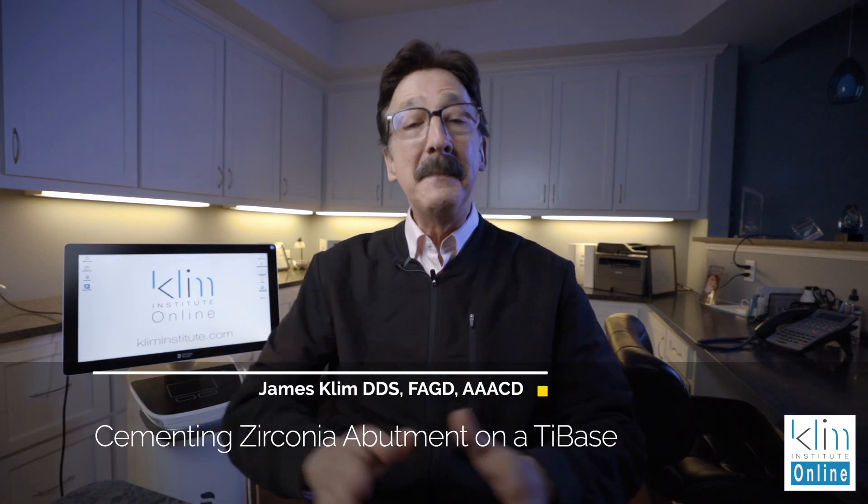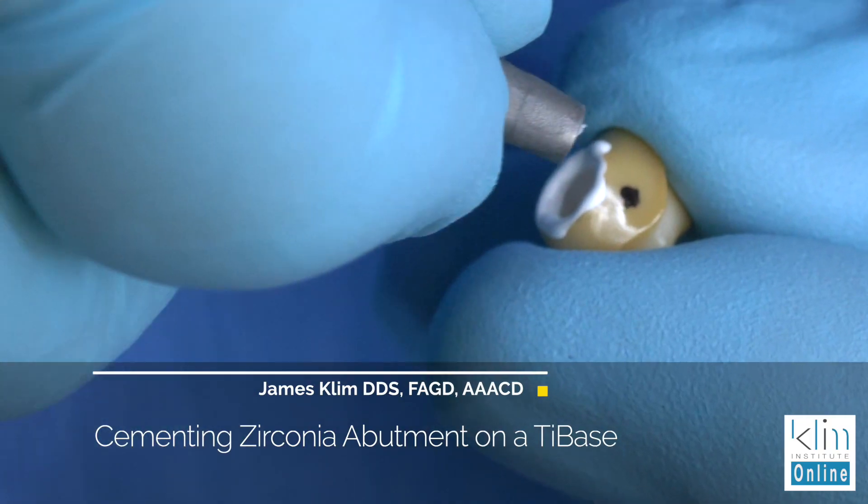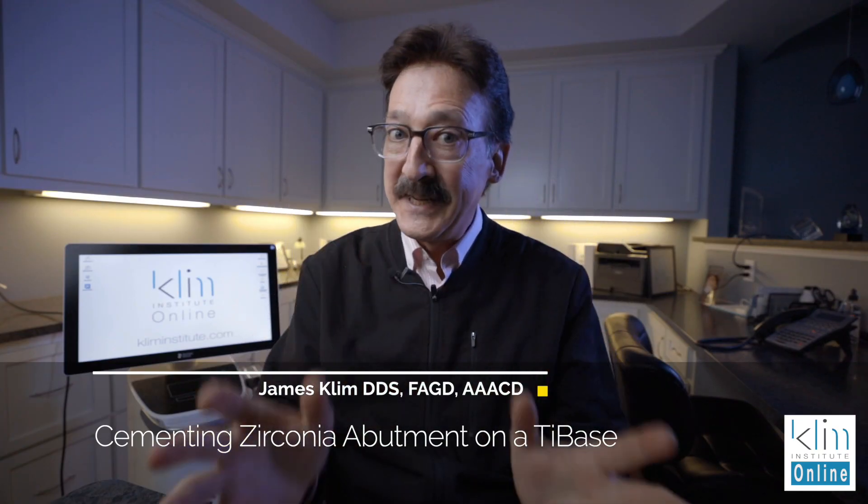Hi, how you doing? My name is James Clem. How's your day going? This video is going to be about bonding a zirconia abutment onto a tie base, and it's really easy to do. Let's go through the products that we need to get this job done.